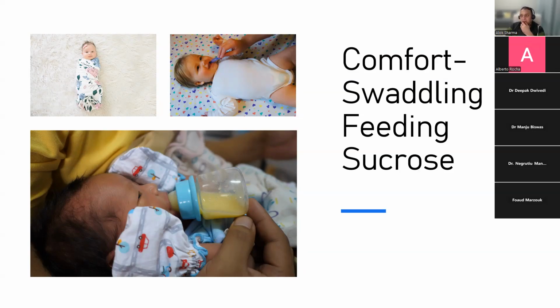There's nothing that works better than being able to feed a baby before you do any procedure. If you can feed the baby either during or before, personally I prefer before, feed him half an hour before, let him be fully satisfied, let him swaddle up, keep him comfortable. For bigger babies, distraction can help. Now, a big challenge of doing a cranial ultrasound in this baby is going to be the hair. It's really going to compromise the image quality.